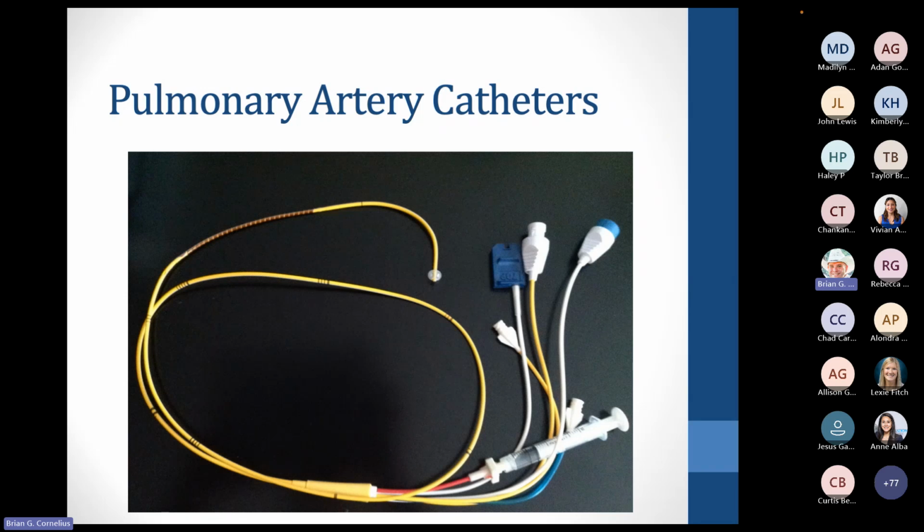Be mindful that you have a clamp on the balloon itself. If you look down at the bottom there where the syringe is, there are special syringes for these. Most of these are going to be 0.5 to 1.5 cc's of air that go into that balloon. There are some other ones out there, but these have special syringes that'll have a stopper in there so you're not putting too much air in.